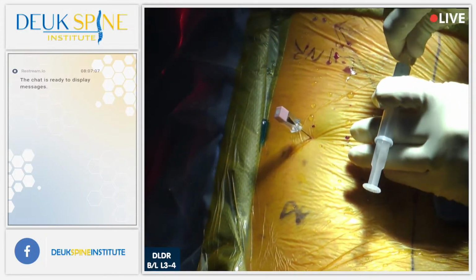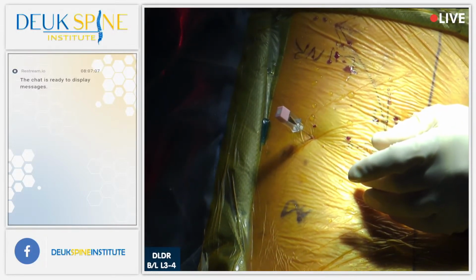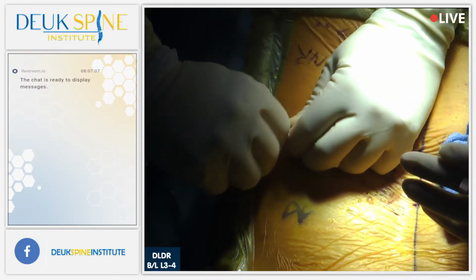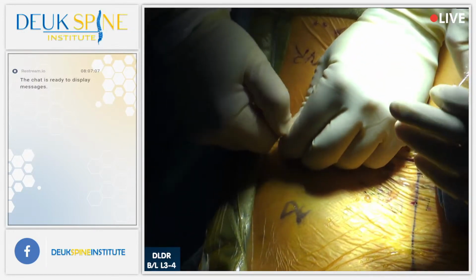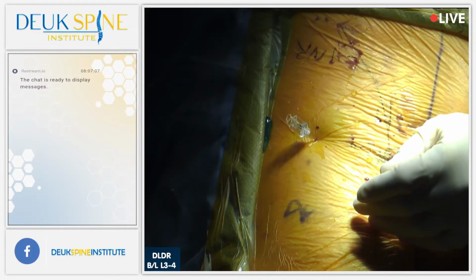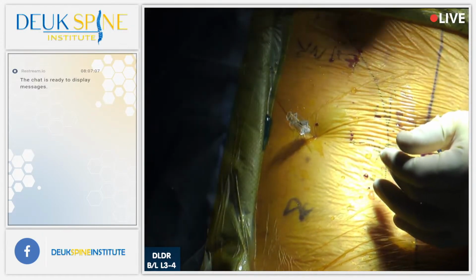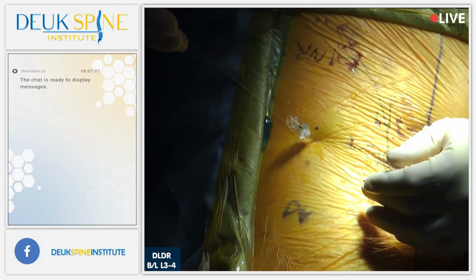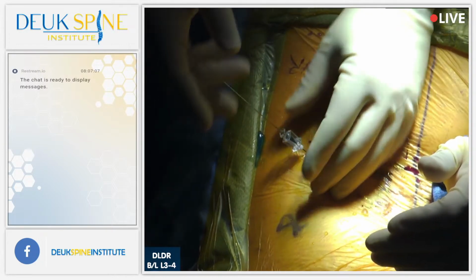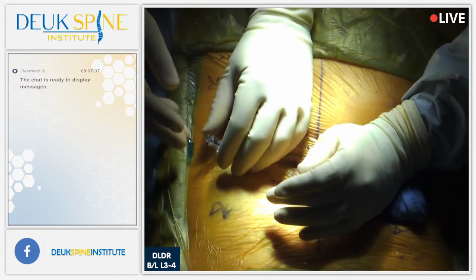I think it's fused. Huh? I think it's fused. Can you check? Are you serious? Check. Well, I know I hit it. So what we were just talking about is that you have to be careful when you have 2 needles in a disc, because if the laser hits the metal of the second needle just right, you can actually fuse the 2 metals together, and then you can't do the procedure. And so we were just checking that.